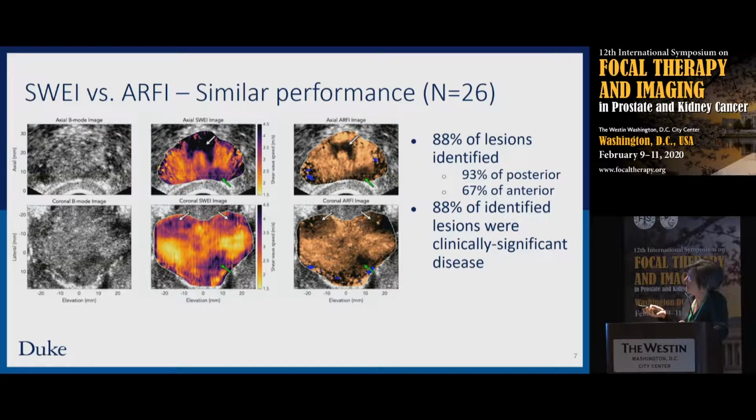And so here you can see that in that cancer, we had a very high shear wave speed of about 4.5 meters per second. I know that number doesn't have much meaning, but it is a quantitative number that will change and that we can longitudinally monitor as it changes.